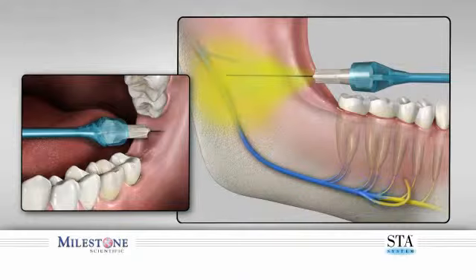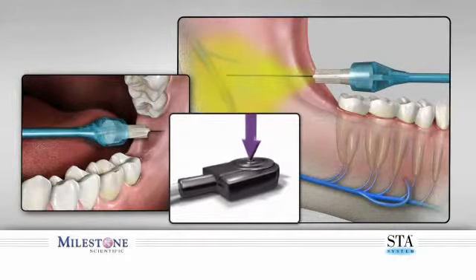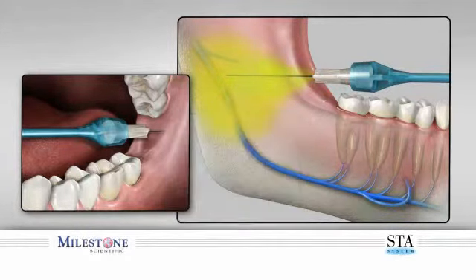It is recommended that the first quarter of the cartridge be dispensed using the control flow rate before you transition to the second faster rapid flow rate. The rapid flow rate is used during block injections only after your patient has acknowledged that they have achieved soft tissue anesthesia of the area being injected. This is acknowledged by subjective statements elicited from your patient.